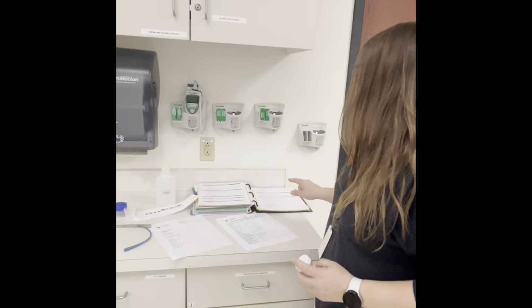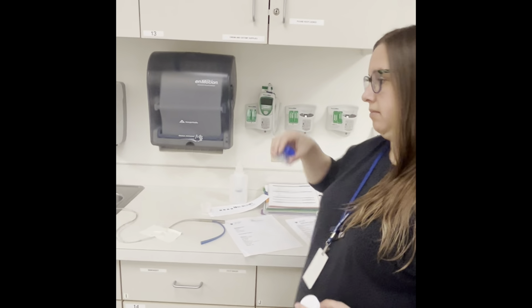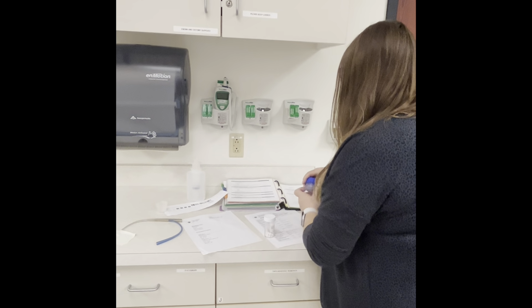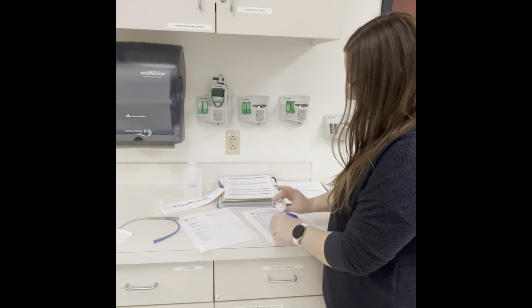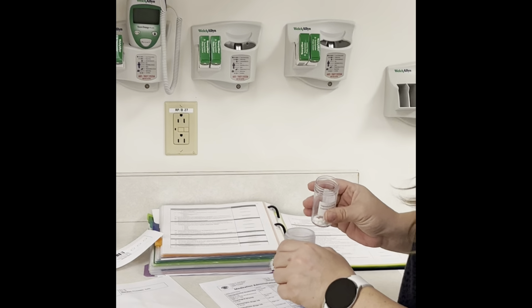Great. So then it tells you number 51, collect the pill crusher. So we need the pill crusher. We are going to open the pill crusher, and we are going to take one pill from the package. We have our one pill.